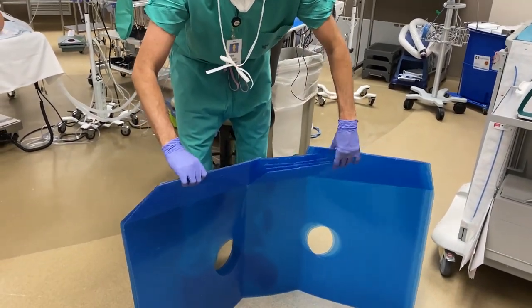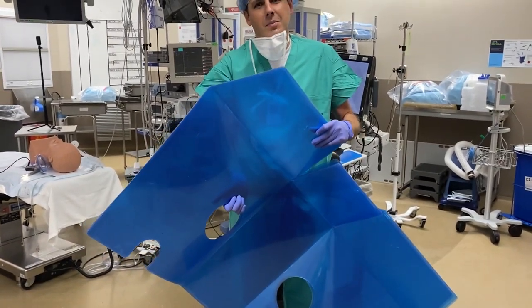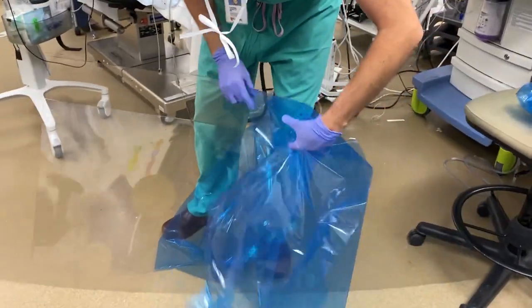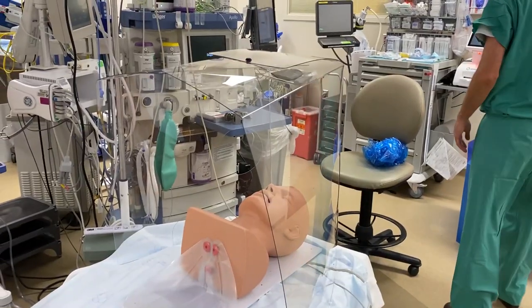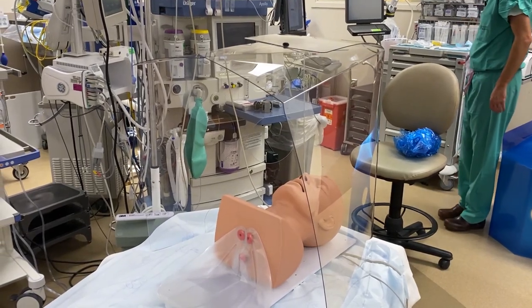The advantage of the lay-flat anesthesia intubation box is that it is very lightweight. You position it over the patient's head going into their body, as demonstrated with this mannequin. You'll notice the two holes on the side for your arms.